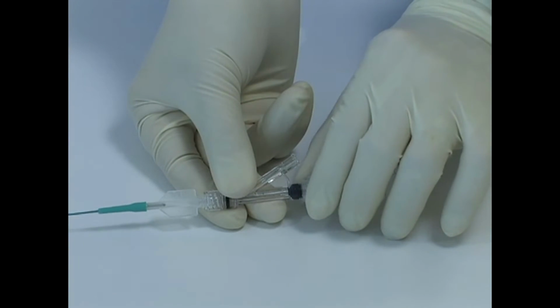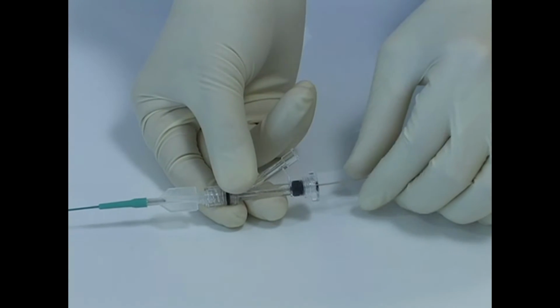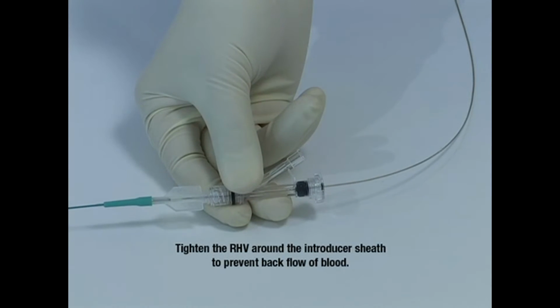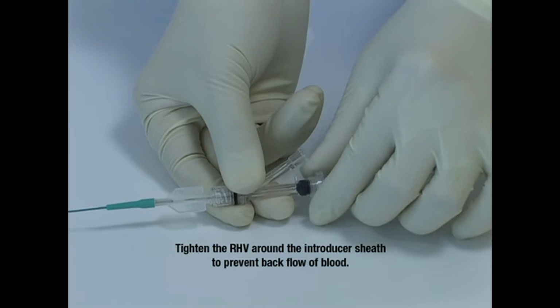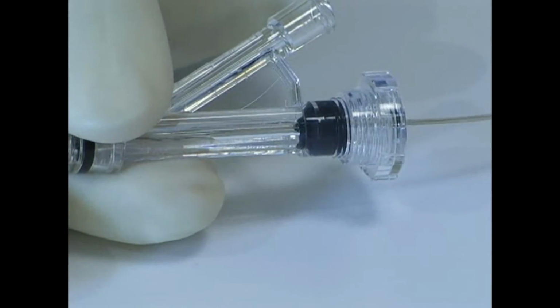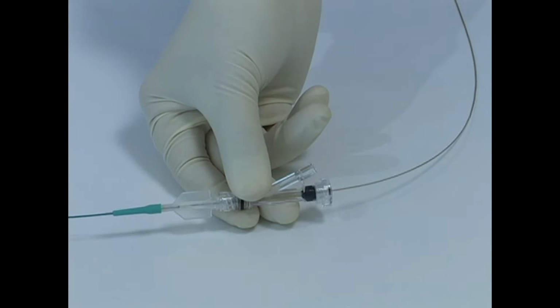Loosen the RHV and advance the introducer sheath until it is firmly seated in the hub of the microcatheter. Tighten the RHV around the introducer sheath to prevent backflow of blood. Confirm that there are no air bubbles trapped anywhere in the system.